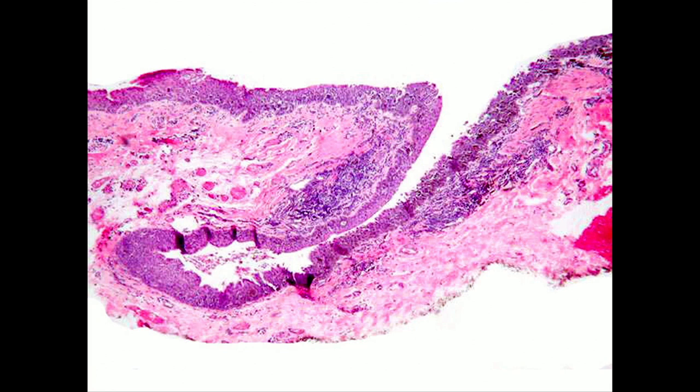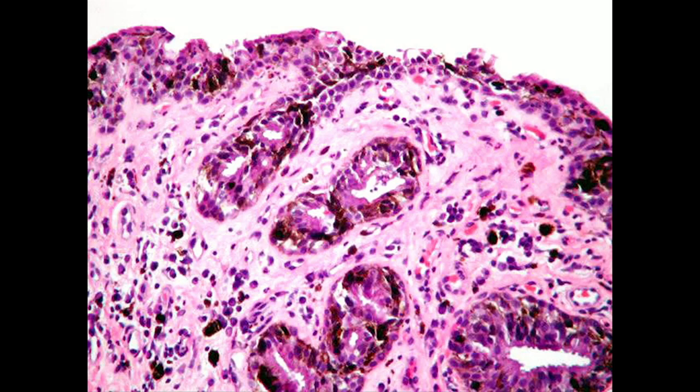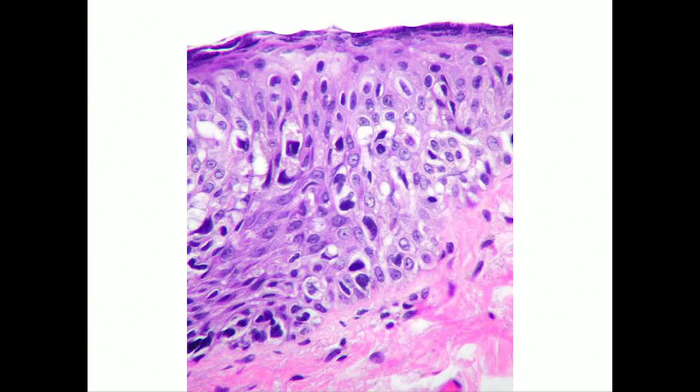Okay, difficult moral question. So here's the pathology. Here you see in the mucosal epithelium melanocytes at all levels of the epithelium. That's clearly atypical. They're extending down the mucosal glands. Although I don't have any to show you, there were rare melanocytes that clearly showed invasion, but very superficial invasion. It also extended to the skin. Here you can see solitary melanocytes predominate over nests. So there's melanoma in situ everywhere.